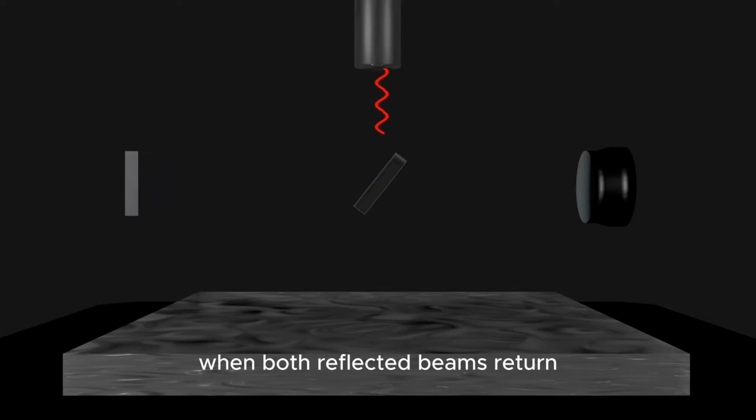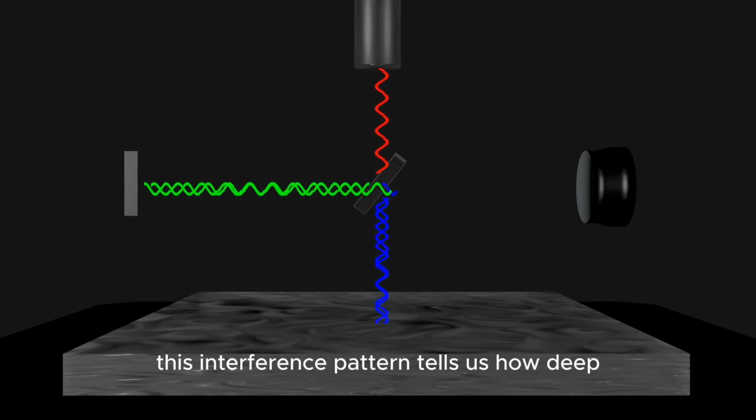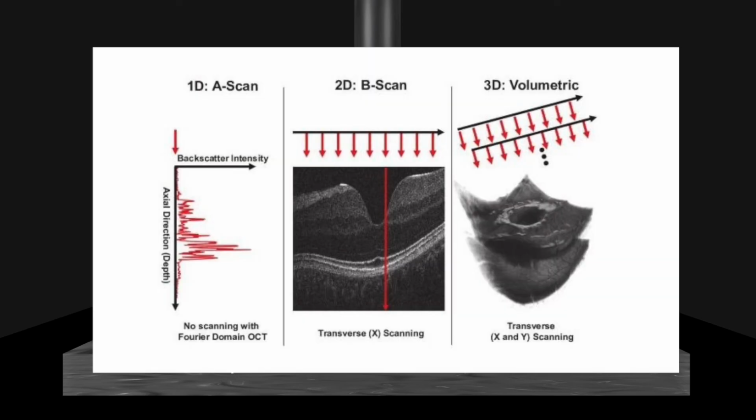When both reflected beams return, they combine again, but they only interfere if they've traveled nearly the same distance. This interference pattern tells us how deep the reflection came from. Each depth measurement is called an A scan. Thousands of A scans placed side by side make a B scan, which shows a detailed cross-section of the retina. Stack many B scans together and you get a 3D image.